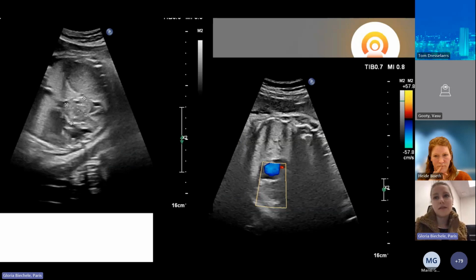In the ultrasound, there was a little flow signal detectable in the left ventricle here, although the mass occupies almost the entire ventricular cavity. But in this image and afterwards, the artifact got worse again. So we finished the ultrasound examination, and clinical indication for MRI in order to assess associated malformation was already given. So as ultrasound conditions were difficult, we decided to add some cardiac sequences.